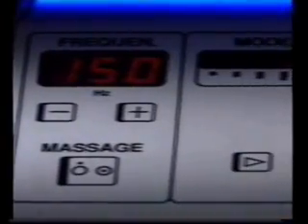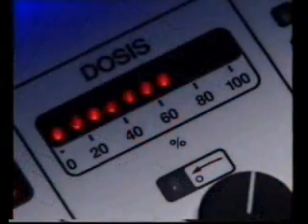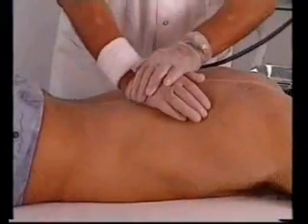Parameter selection depends on the individual tissue conditions and the treatment technique applied. The vibration is adapted to the consistency of the tissue by varying the mode function, frequency, dose, treatment pressure and velocity.